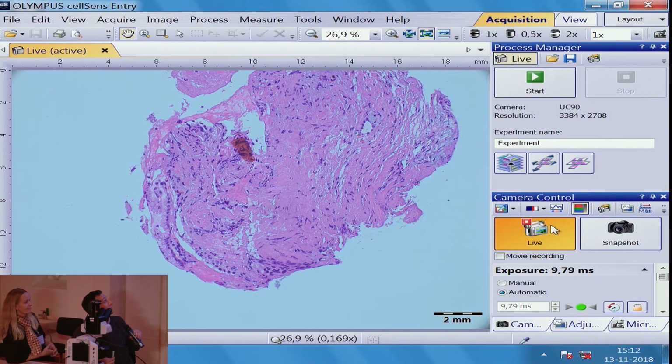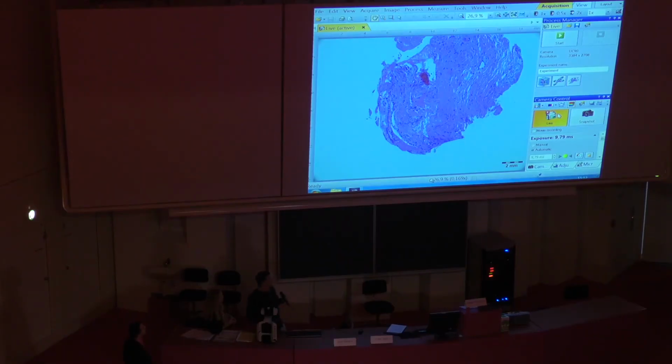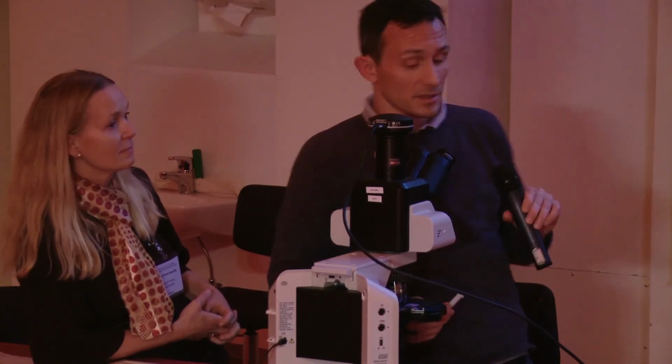But we would expect this to stain with the gastric markers and not with the intestinal and pancreatobiliary markers. It's not always very easy to do this subtyping, and there's some uncertainty as to how the different markers stain the different subtypes, but we would certainly expect this to come out as a gastric subtype.